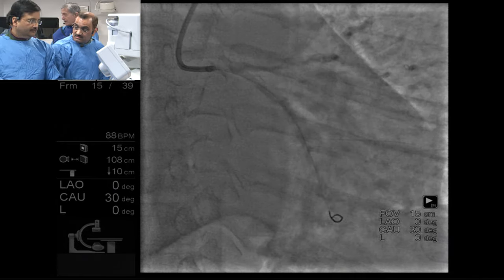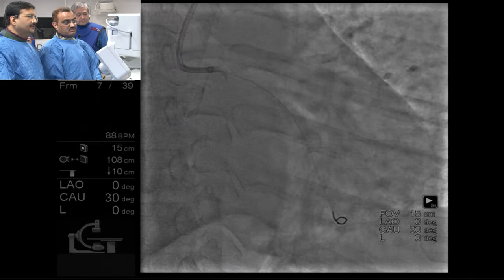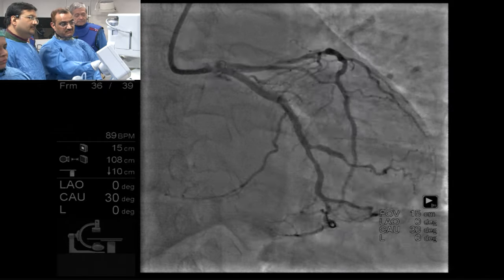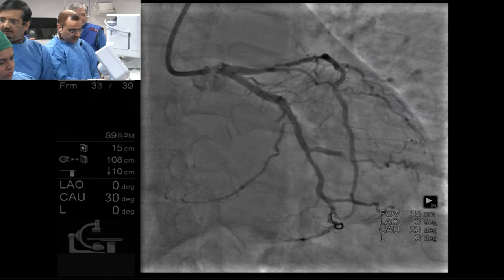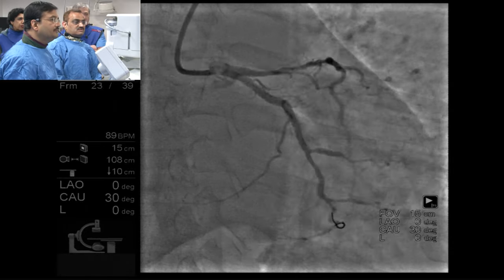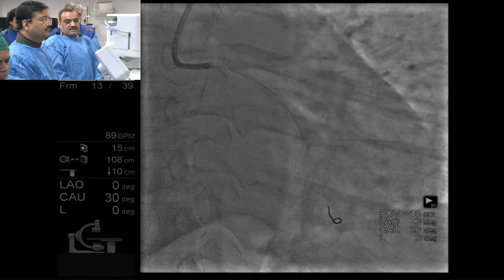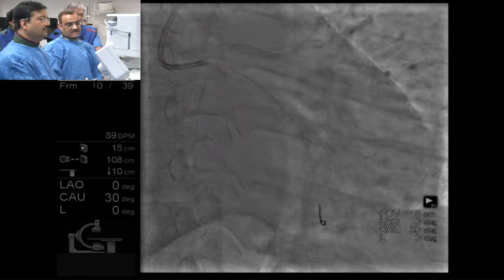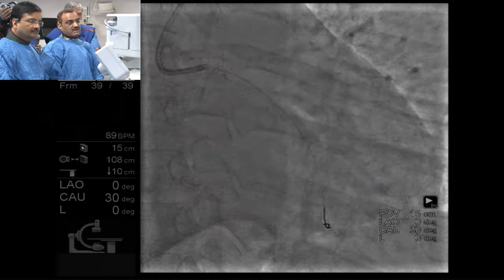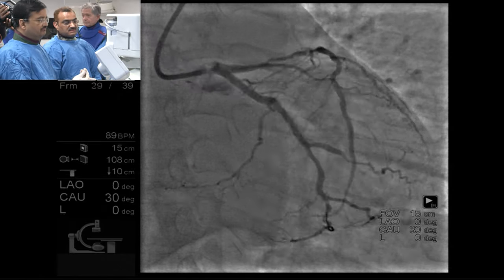2.5, 32. Yeah. But with a double stent strategy, I feel that one should do a final kiss, definitely. Do it first and then. That's my feeling. I think for any crush stenting, if you don't do final kissing, the MACE is quite high. I try not to cross and kiss again if the result is good. I agree with you. I think we can flare that ostium with an NC balloon. So I'll rewire that and then put an NC balloon in it and open it up. Yeah, I think that's the minimum I would do.